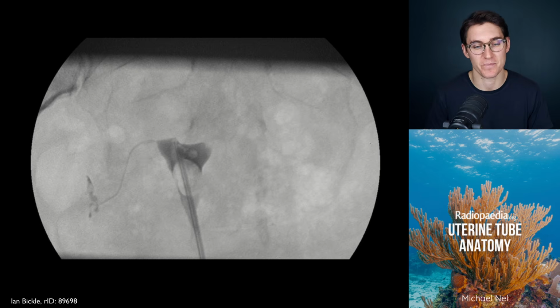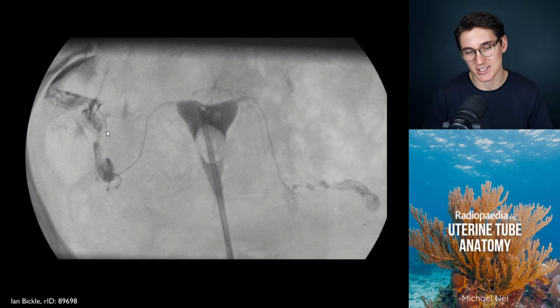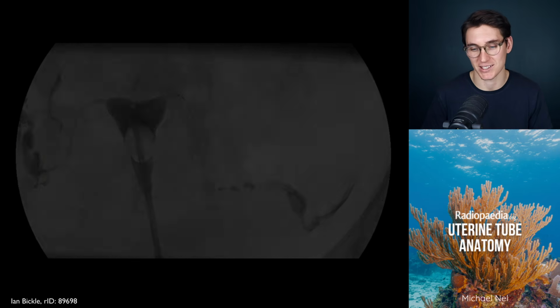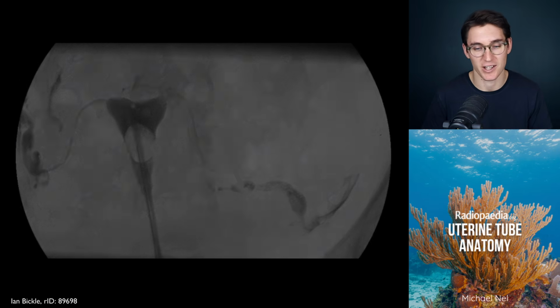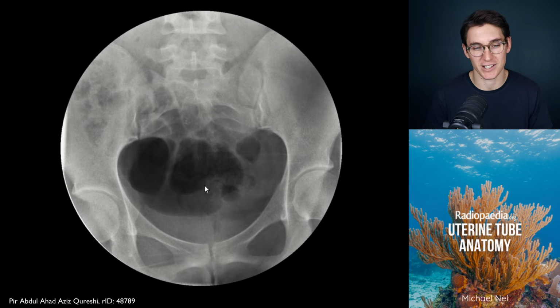the uterine tube is. As we continue with the study and inject more contrast, we can see the left uterine tube being filled as well, and we can start to see contrast spilling out into the abdominal cavity, the same on the left-hand side as well, until the end of our exam. These are normal uterine tubes. We can look at another case here.